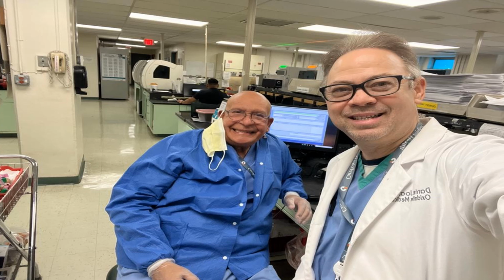So by leaving the tourniquet longer than 1 minute, that will alter test results and it will give you what is known as hemoconcentration. Remember, tourniquet cannot last longer than 1 minute. The question is, in reality, in ICU, can I leave the tourniquet for longer than 1 minute? Should I remove the tourniquet for longer than 1 minute? We're going to talk about that in another series because that's something else that we have to talk about.